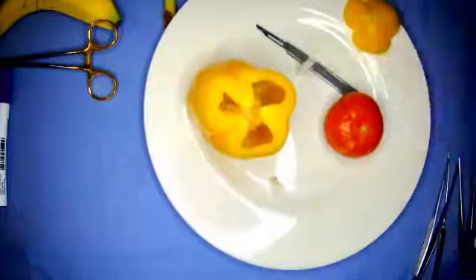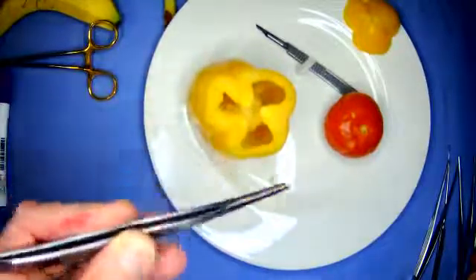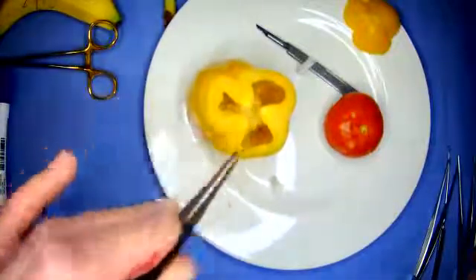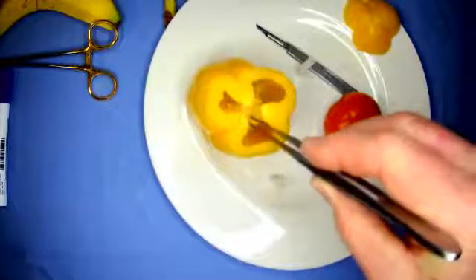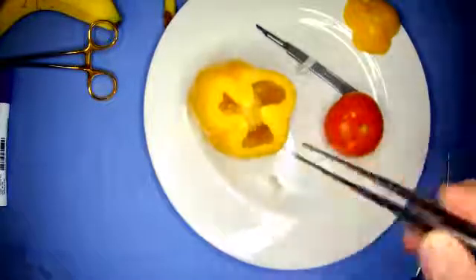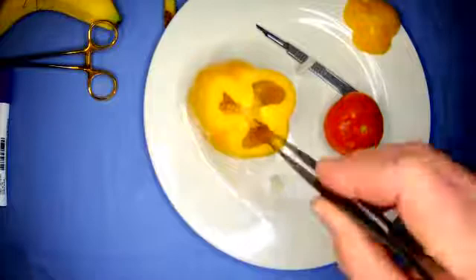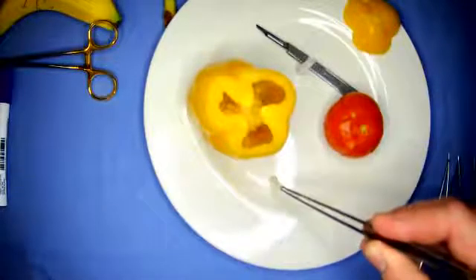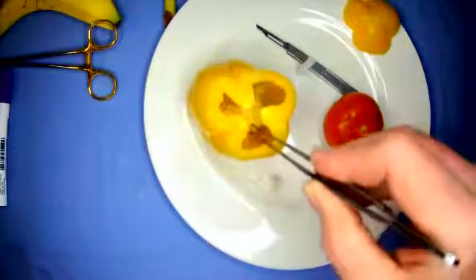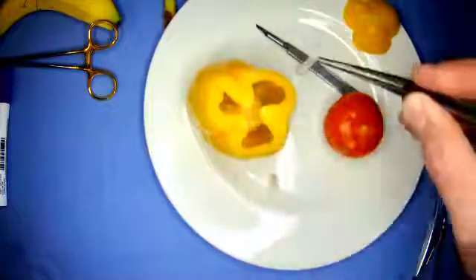You can't grab them. If you use the word grab, you're missing the point. I would call them a lumbrical instrument. A lumbrical instrument to remind you that you're not to grab with your forceps. So once we have practiced our precision on these models, our next thing to think about is delicacy. Not grabbing, but now forceps are used in tissue planes to delicately lift and separate membranes.